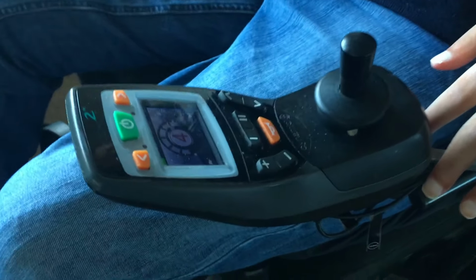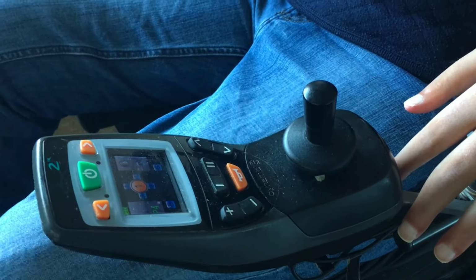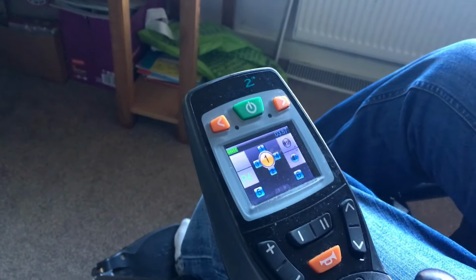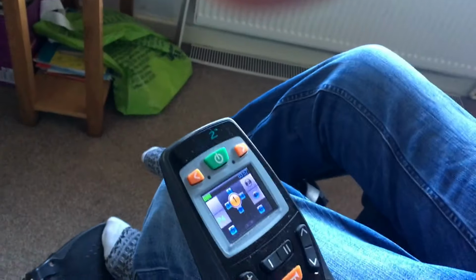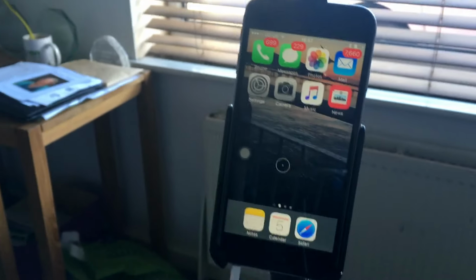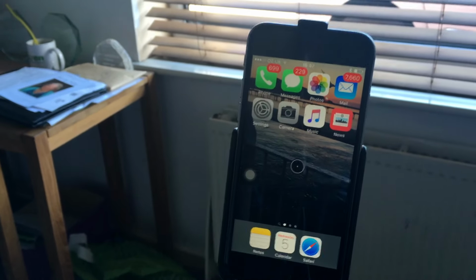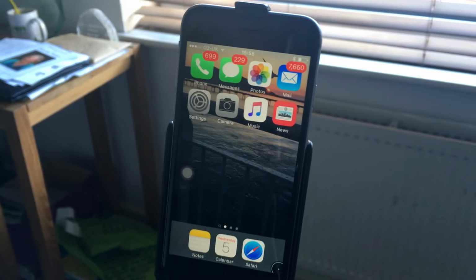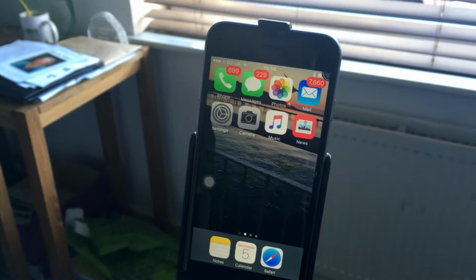And if we now focus back on the DX2, it might sound complicated, but as I'm flicking, just have a look here, Will, onto a different system, the Dynamics mode rather than number 4, which is to use a wheelchair, which means rather than drive, when I press this and focus on the screen, I've actually got a cursor on the telephone, which by navigating my chin up and down, I'll go to the top left hand corner, bottom right hand corner, all of which I'm just simply doing with the chin, just like I drive a car. I'm just driving and navigating around the screen.